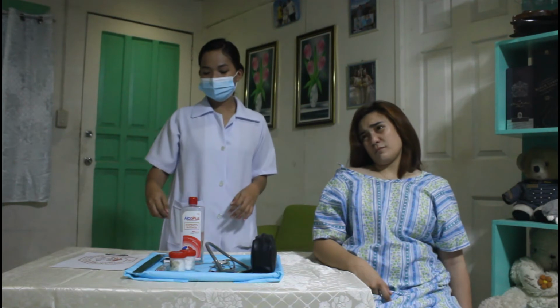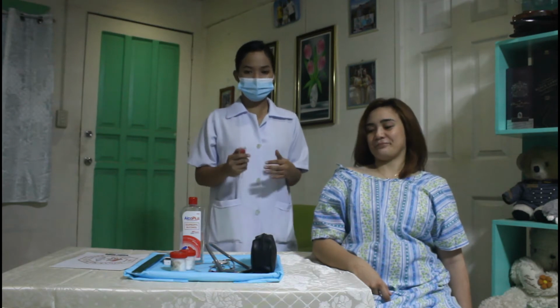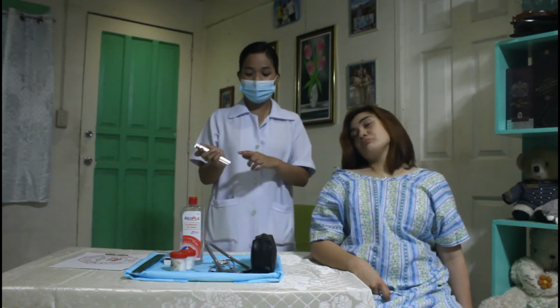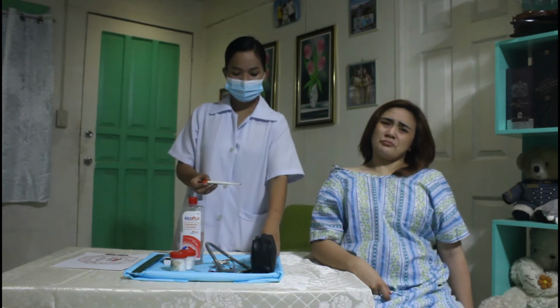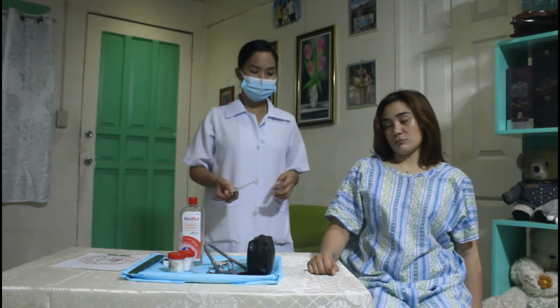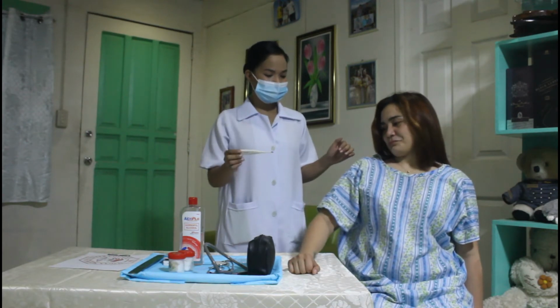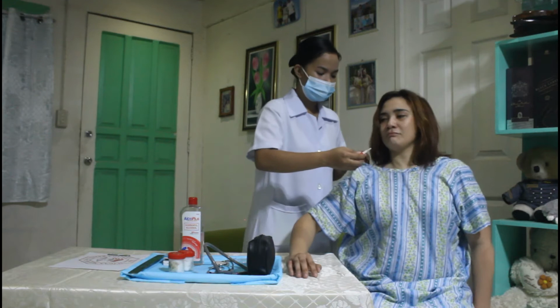And then remove the digital thermometer from storage. This is to provide precautionary measures to ensure the client's safety and also to have access to its sensor. So now we obtain the temperature. We ask the patient to raise her arm away from the torso. Ma'am, kindly raise your arm away from your torso so that I can insert this digital thermometer accurately. Right, thank you.